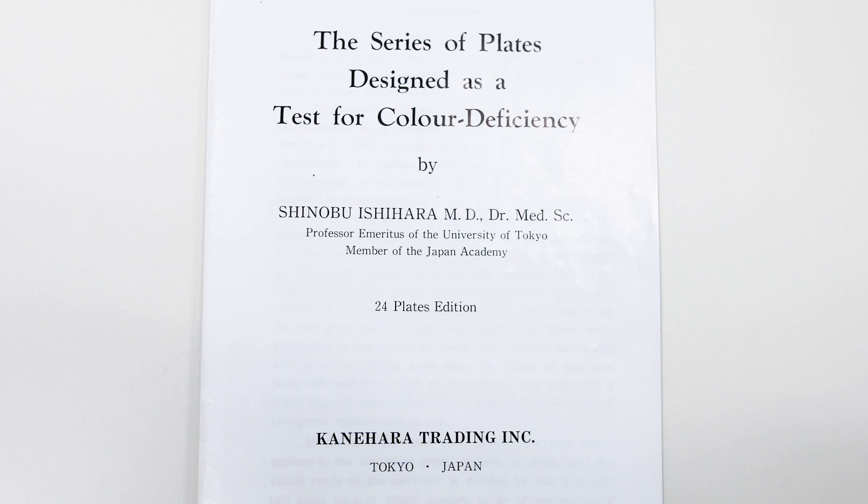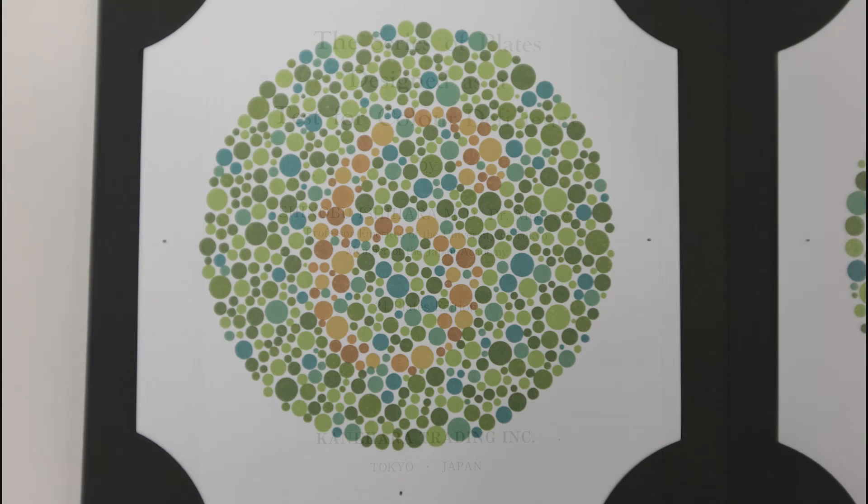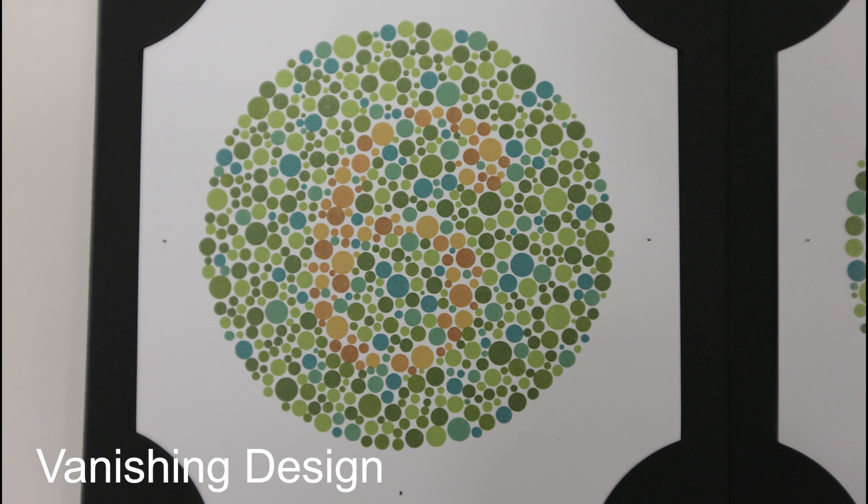In this video, we'll be looking at a different test for color vision called the Ishihara test. This test, which we'll walk you through in a moment, has four different types of plates which comprise the test. Those four different types are a vanishing design, and only people with good color vision can see that design — if you're colorblind then you can't see anything.